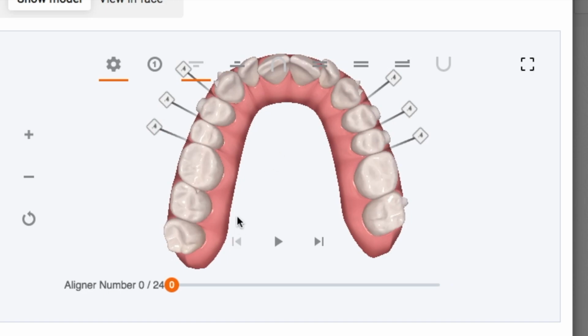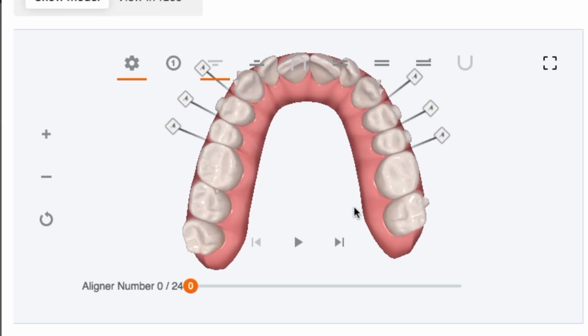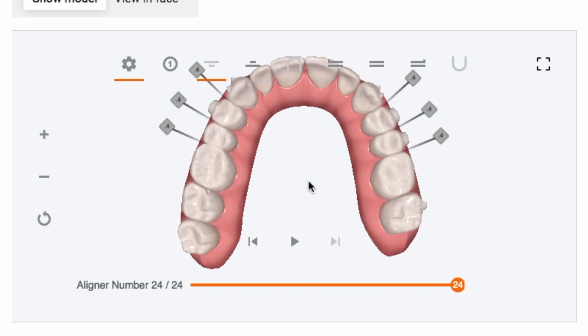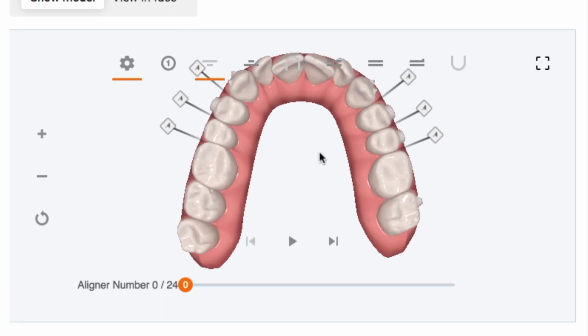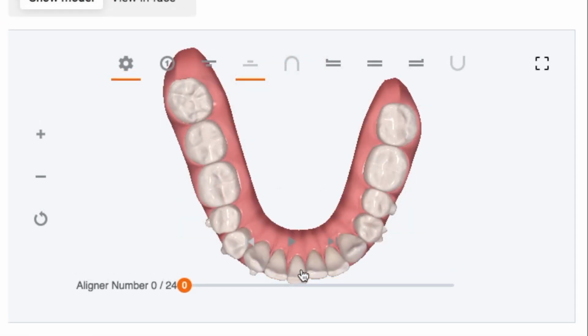I didn't mention this before, but you can see on the right side, remember this is an upper view. This is if you were looking up to my teeth. On the right side, I have a third molar. My wisdom teeth came in on the right side, upper and lower, and that's part of the reason why everything's so crowded.